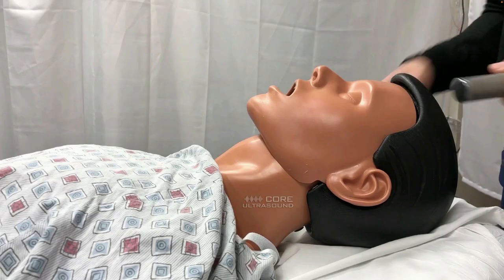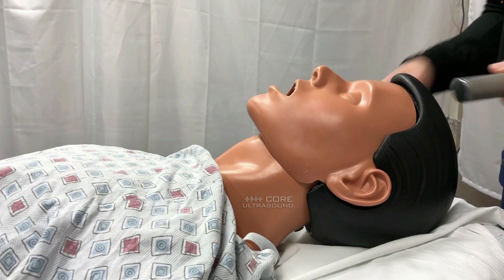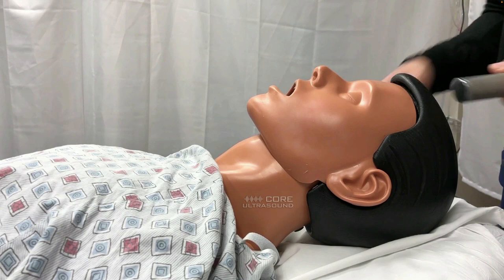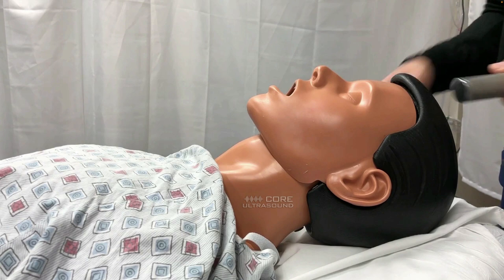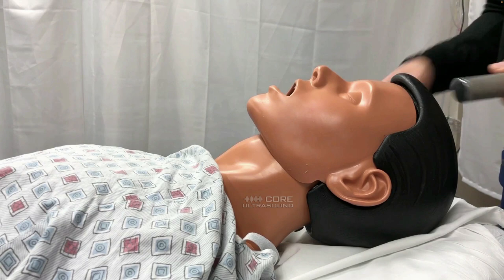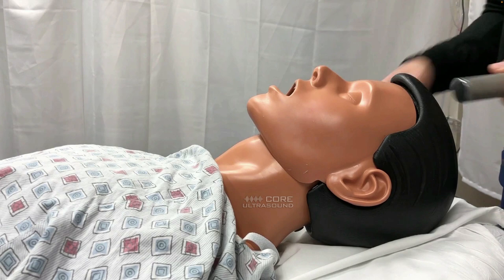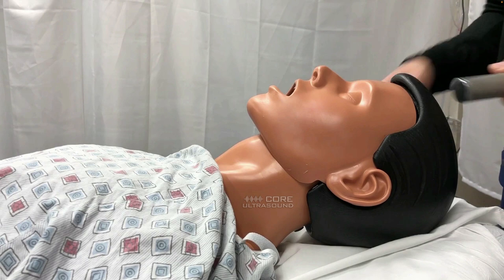There is something fairly important to understand with regards to the practicality of doing this on an actual patient. I'd actually recommend doing a survey scan before the intubation, just to know exactly where the trachea is, where the best window is, and to identify exactly where that esophagus sits in the neck. Usually it's on the left, but sometimes it's on the right - and sometimes honestly it's directly behind the trachea, which is one of the reasons why I like looking at it laterally. If the esophagus happens to be posterior to that trachea, placing the probe laterally means I'll still be able to see the esophagus because they're a little more side by side, so the air artifact from the trachea doesn't obscure it.